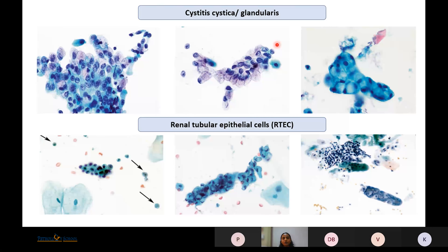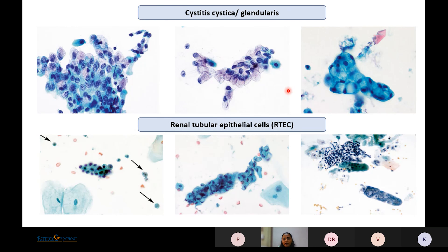Cystitis cystica or cystitis glandularis can appear as clusters, in a linear pattern resembling endocervical cells, or as tightly cohesive clusters. If the nucleus is not hyperchromatic and has no irregular contours, irrespective of origin, it is placed in Negative for High-Grade Urothelial Carcinoma. Renal tubular epithelial cells — histiocytic type, clusters, or casts — are not positive for malignancy and are also placed in this category.